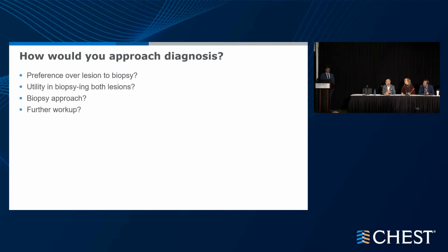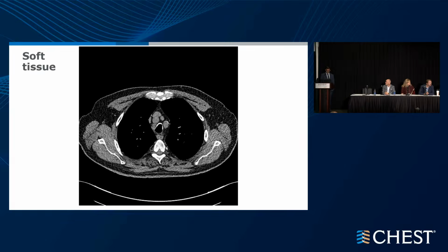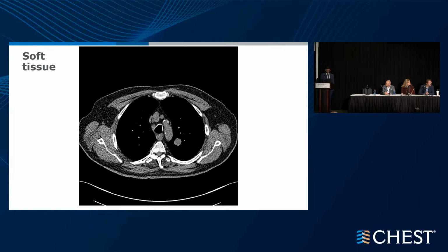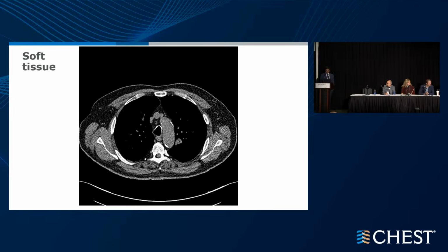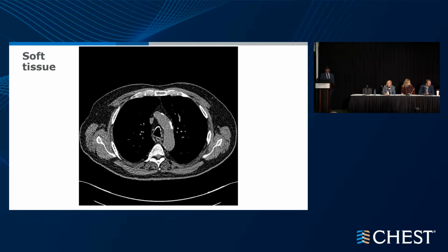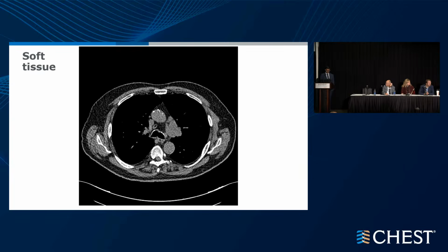Yeah, so I'm just going to go through this real quick here, and I'll show you the soft tissue windows, the relevant lymph node. It's a non-contrasted study, but there's a radiology arrow sign here. Solid. Nice big obvious one, right? But as I come down here, you'll start seeing the left mediastinal area there.